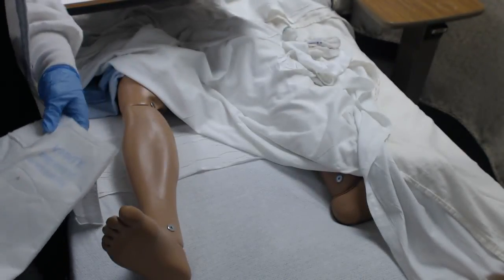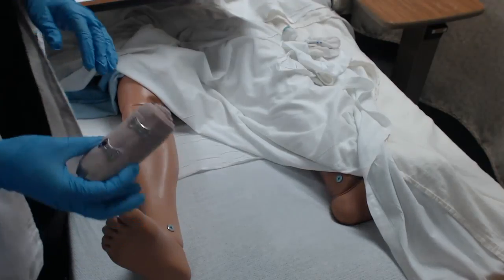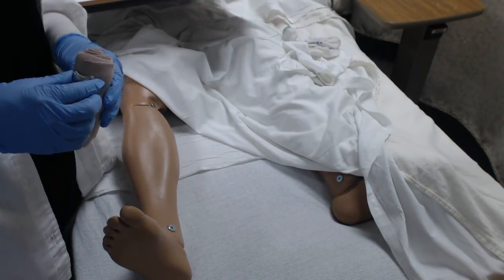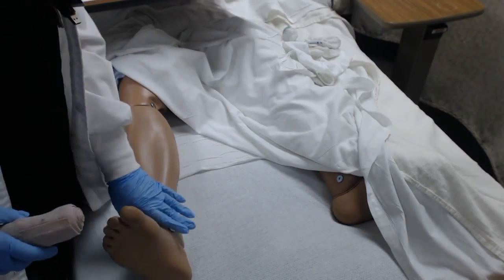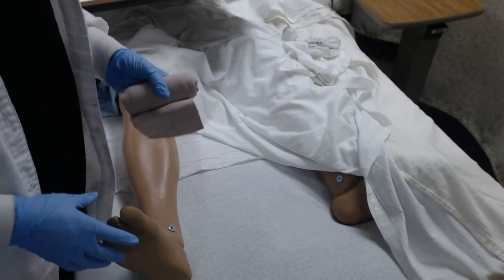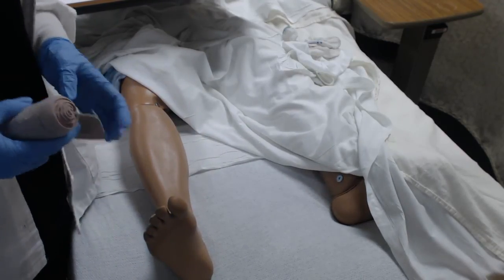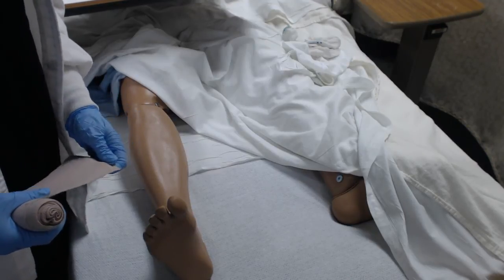The last piece that we're going to cover is ACE wraps. And ACE wraps really are beneficial for a lot of patients, especially patients who are so edematous on their extremity that a TED stocking or a compression device would not work for them, as it would be too tight and uncomfortable.